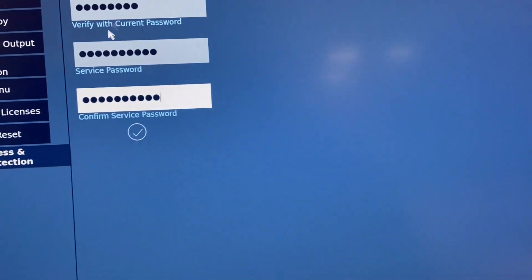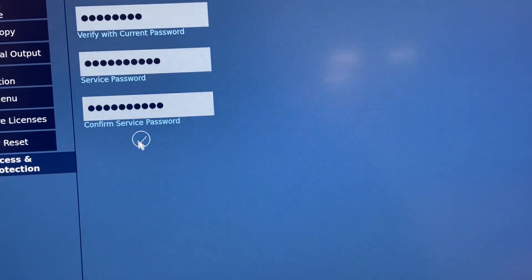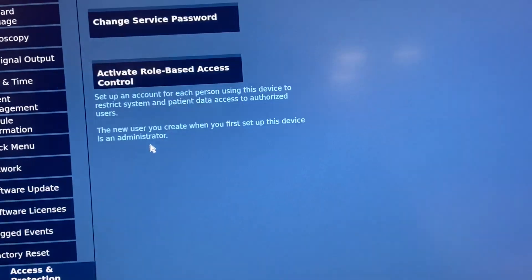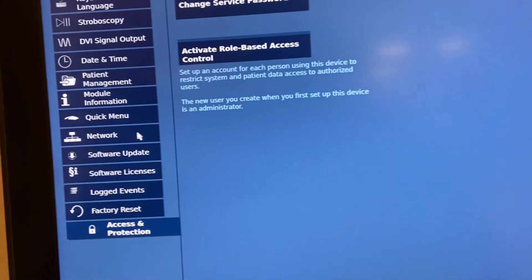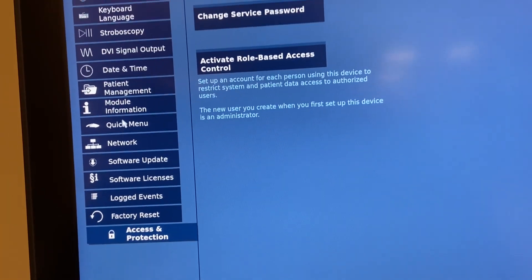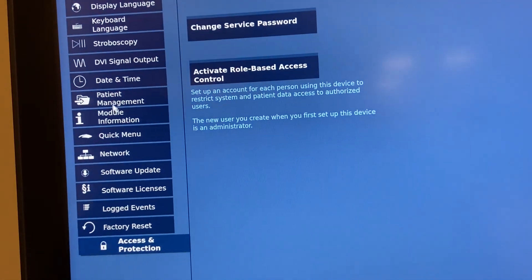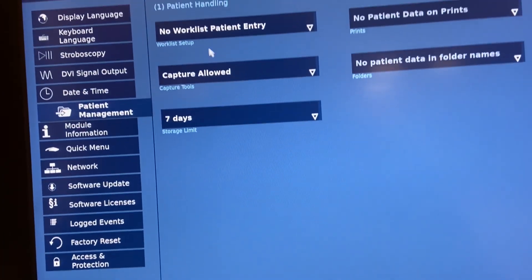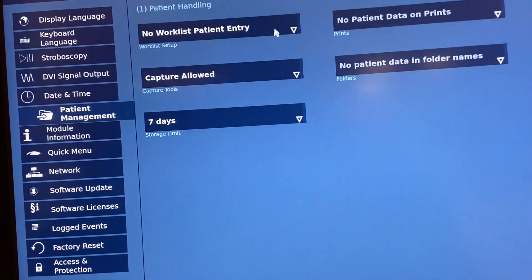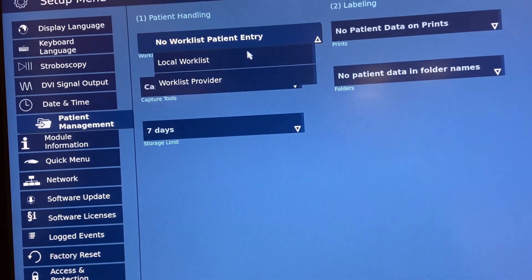Then click the check mark. And now you can access patient management. And you want to click local work list.